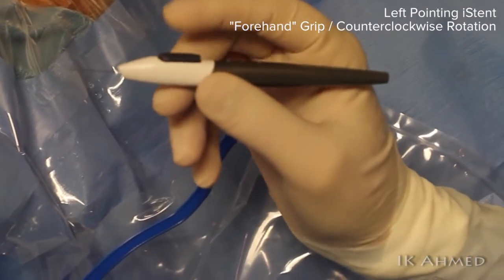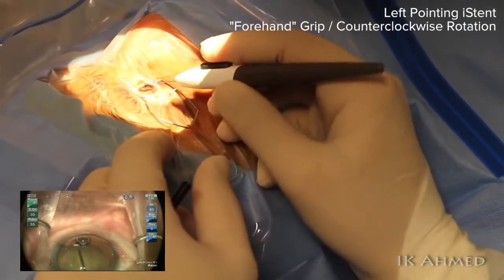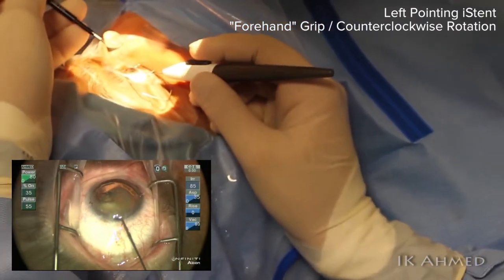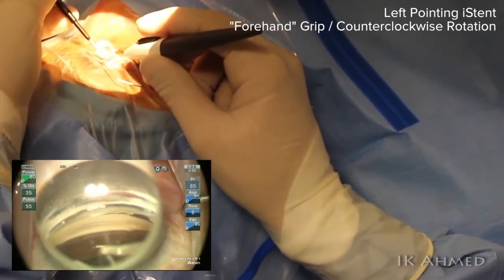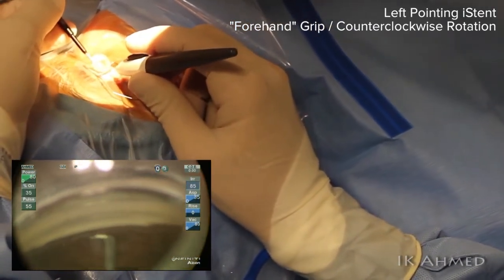This is the forehand grip. Notice that the applicator is held like a pen, and our wrist motion will be in a counterclockwise fashion. This is a left-pointing iStent which will be placed to the left field of view on the angle, which allows for the best ability to place the device accurately following the contour of the angle.